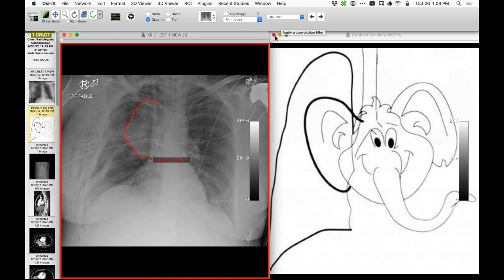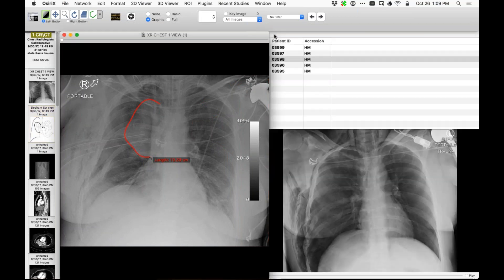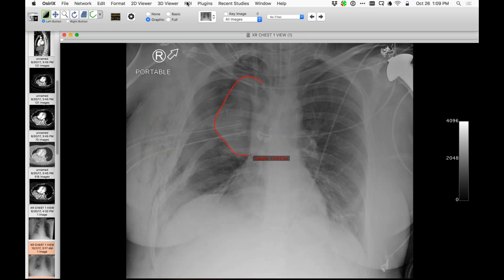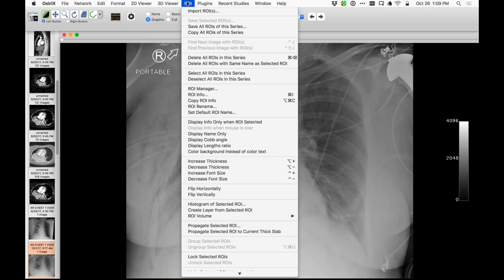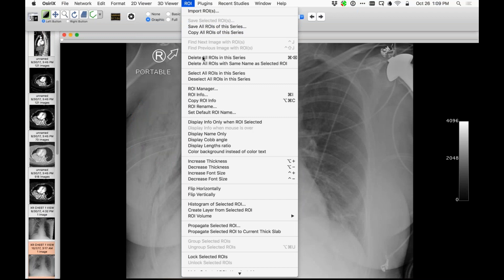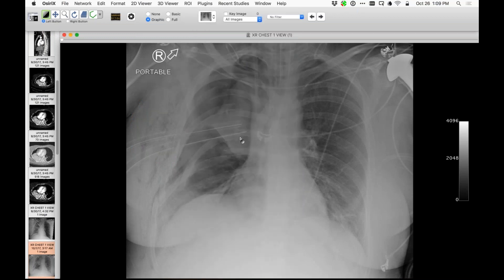What I'm trying to show is there is an opacity that has that shape, which on this projection is the elephant ear. Let me now make that go away and take away the red stuff I put on there. What I'm trying to diagnose here is the presence of right upper and right middle lobe collapse, the rest of the lung being the right lower lobe.